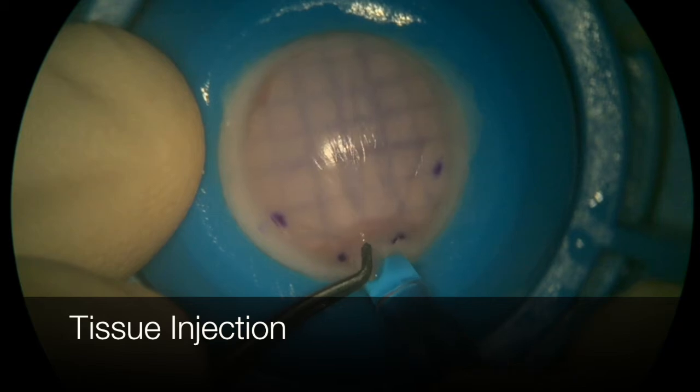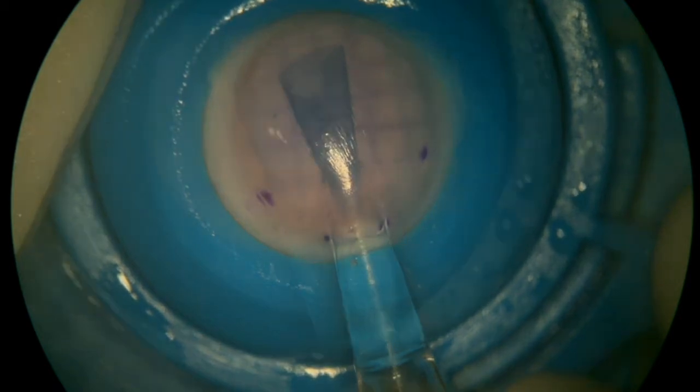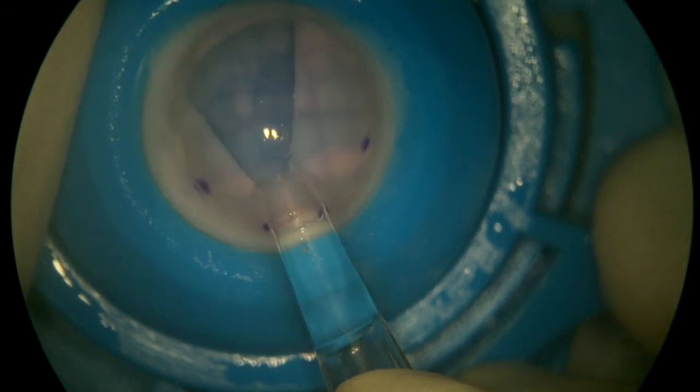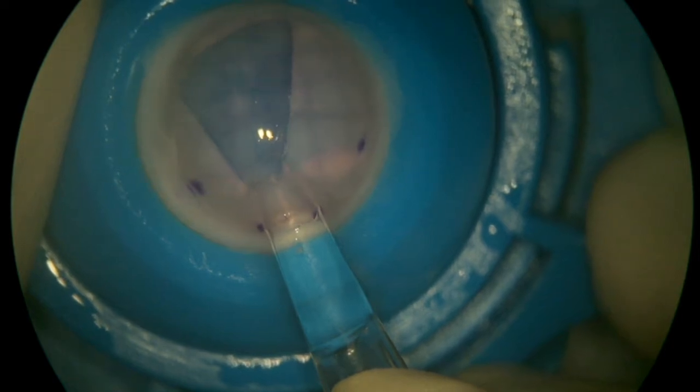The interplay of pressure and volume between the anterior chamber and the posterior segment can be seen with tissue injection. Here, the tissue is injected and volume of the anterior chamber is increasing, which is why you see the latex diaphragm bulge posteriorly and come into contact with the blue surface of the artificial anterior chamber.